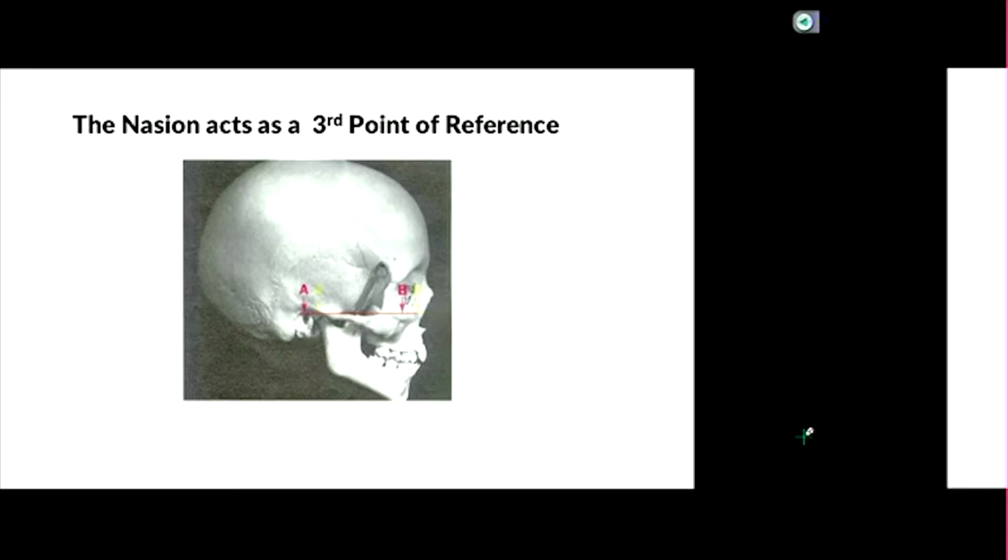Okay? So once you've captured and locked that bottom component, these two bottom screws, then you've done your job. Okay? And of course, you have to unscrew these because you have to get it out of the patient's ear. So again, this is loosened too. This is loosened. All that, you no longer need. Okay?